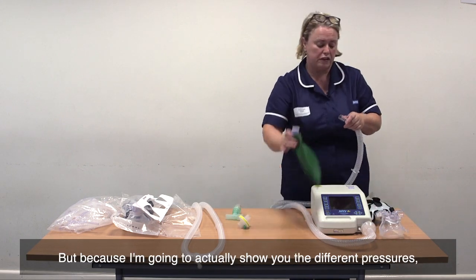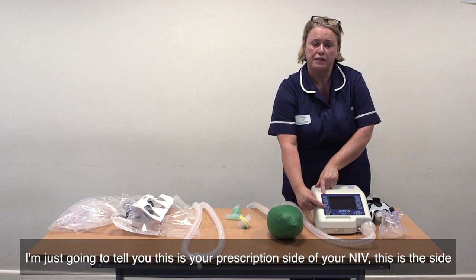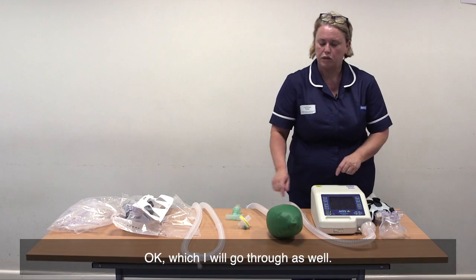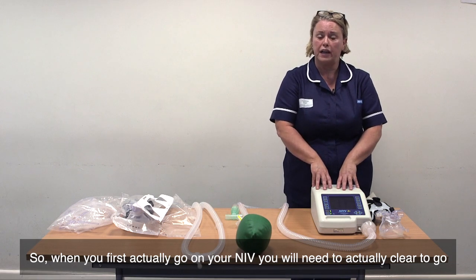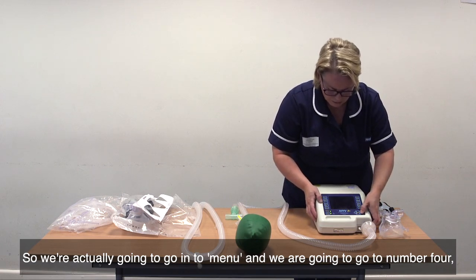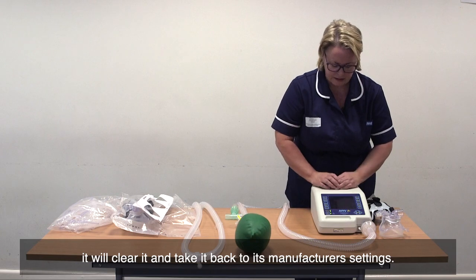Because I'm going to show you the different pressures, I'm going to put my lung back on. We're actually going to turn it on at this point, and while it's warming up, I'm going to tell you: this is your prescription side of your NIV — this is the side that we will be delivering — and this side is all about your alarms, which I will go through as well. When you first go on your NIV, you will need to clear it back to its correct settings, back to its manufacturer's settings. Go into menu, go to number four, clear patients, and set it. It may alarm at that point — if you just press plus, it will clear it and take it back to its manufacturer's settings.